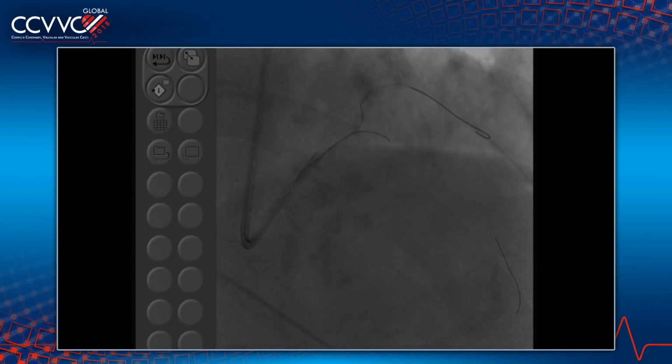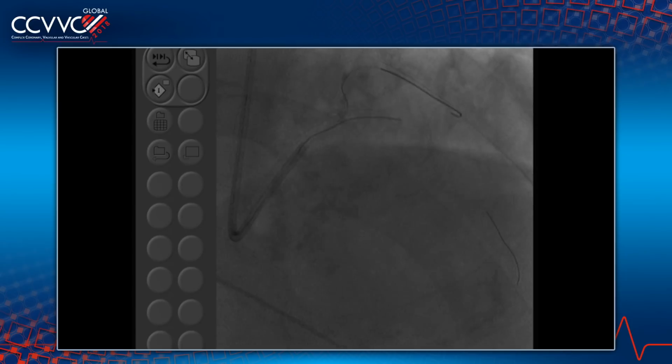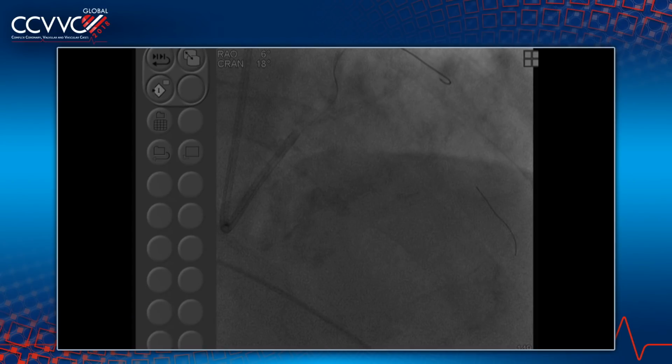So anyway, this is now a Fielder, as you know, those who have been using the RunThrough, it has been on back order, some issues with the America and Japan trade. Oh, is that right? Yeah. All the products from Japan are in Dr. Tierstein's lab. True. So now what you're working with is a Fielder Marvel. Yeah, Marvel. Okay. And so the idea here is now that you're going to do a mini crush.